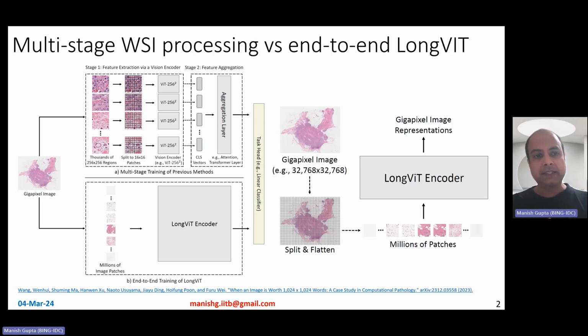Now, these glass slides, of course, can be scanned. So the scans are typically very large in size. A typical scanned whole slide image, as it is called, could be pretty large, on average about a GB in size. So you take this gigapixel image, right?